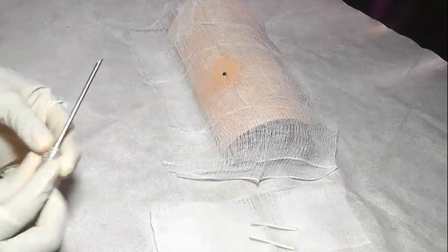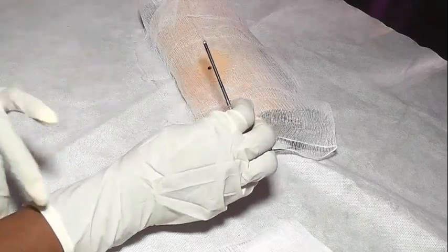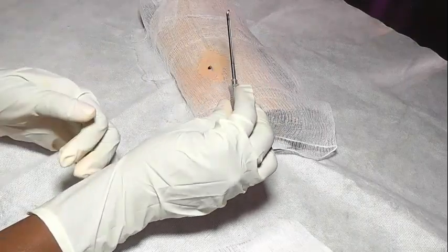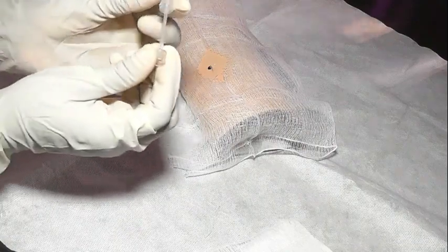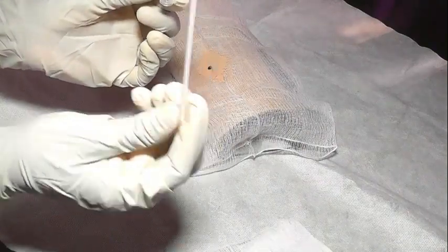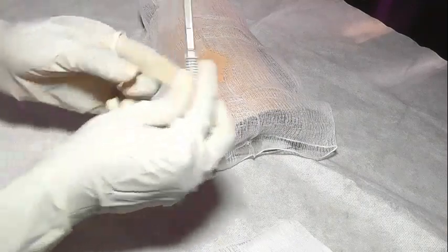Okay, so this is it. So I'm going to start inserting the trocar. Now this is the trocar, the whole of it. Then we have a plunger inside this. This is what we call the plunger. We use it for introduction of the rod.